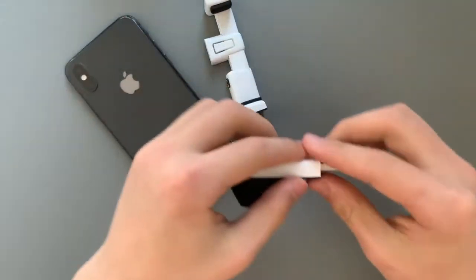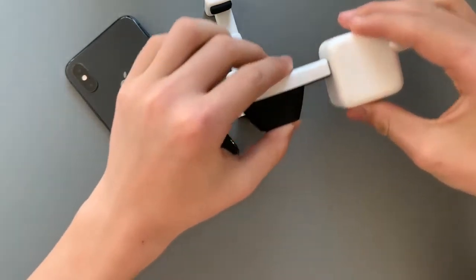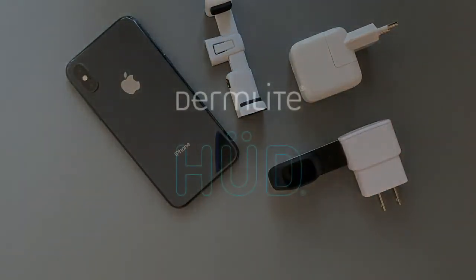To charge Hood, remove it from your phone, disconnect the DermLight dermatoscope, and plug it into any available USB charger, including the charger that came with your iPhone or Android device. This is DermLight Hood.